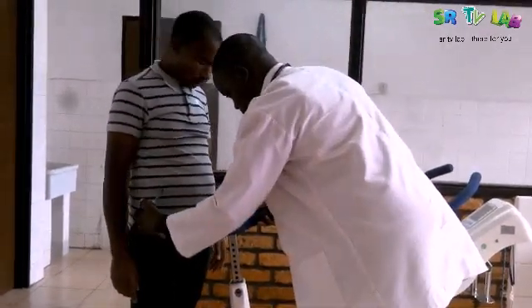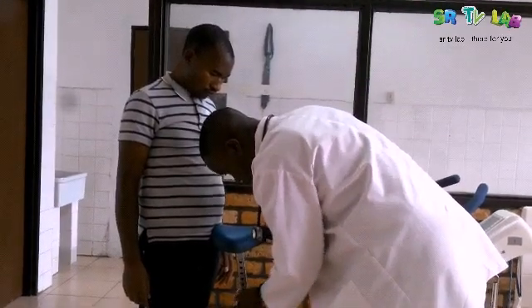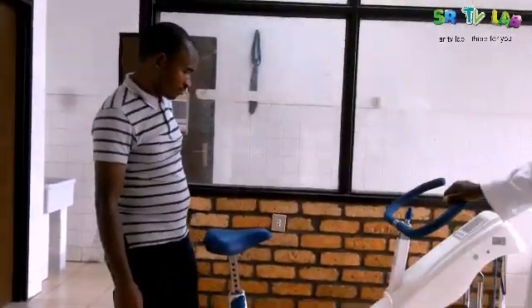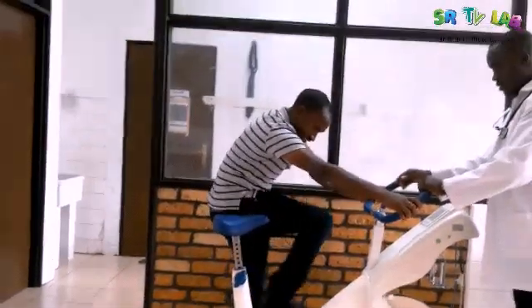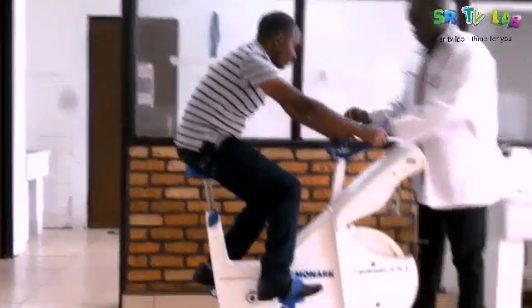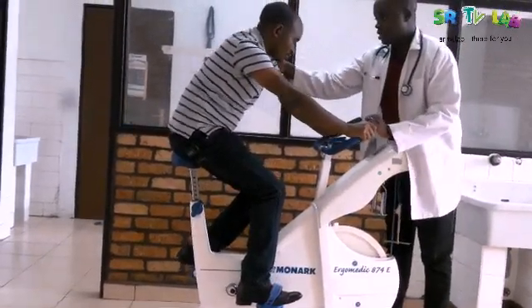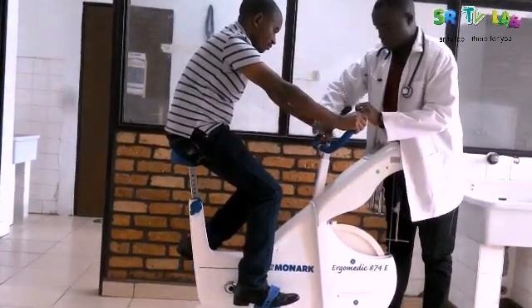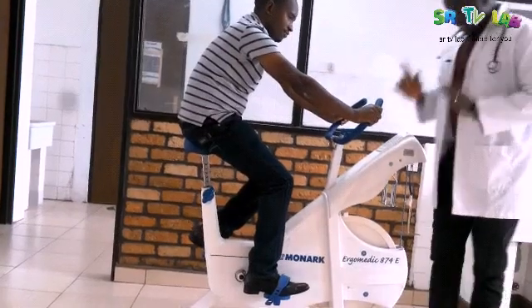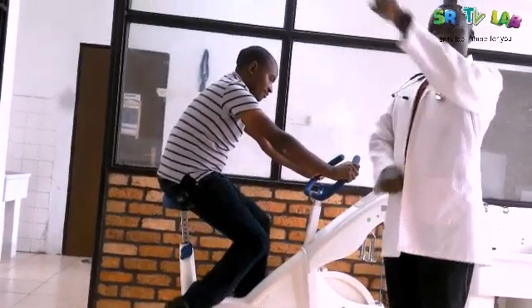This seat has to be at the waist level of our patient. This is the best level. I am also happy to adjust this handle as well, so that our patient will be comfortable to pedal.